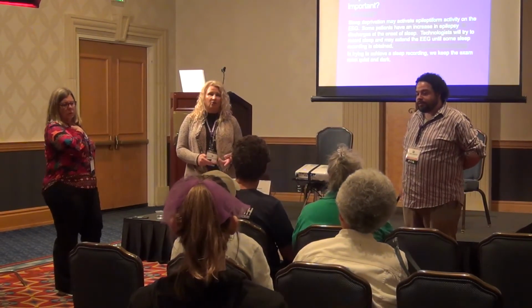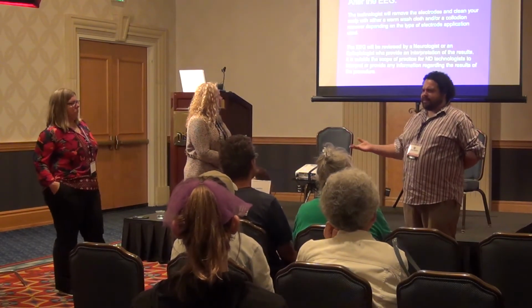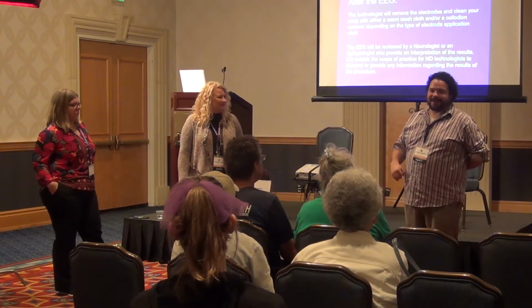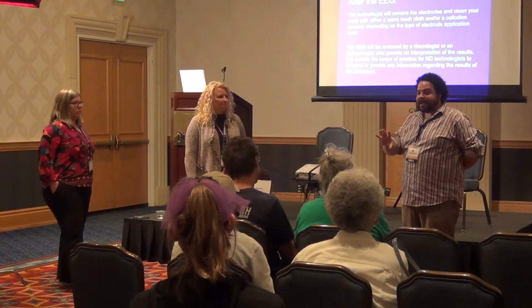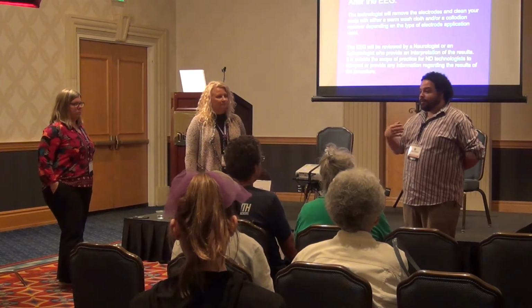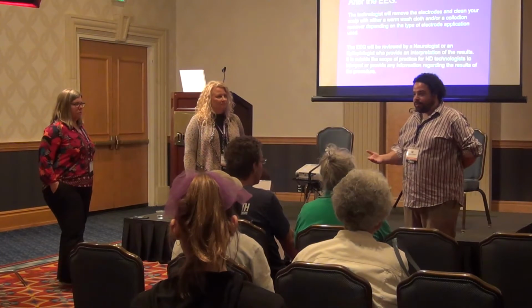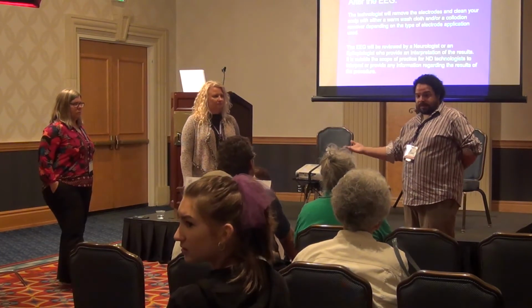Right. No, wonderful question. So with the activations that we do, some of you might wonder, why do they get such weird instructions before we go to the EEG? Like, don't put gel in, make sure your kid stays up till midnight and wake them up at 4, things like that. Because we want to try to create a similar environment in the brain as there is when the patient is having a seizure. So with sleep, for example, a lot of seizures happen at night when people are sleeping, and so we want to try to get sleep-deprived patients so we can get them to sleep in EEG.